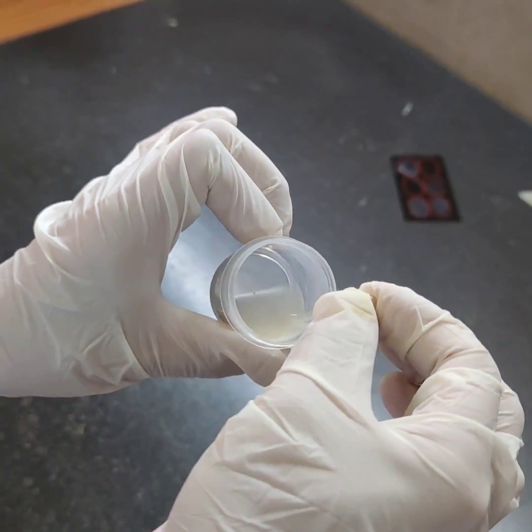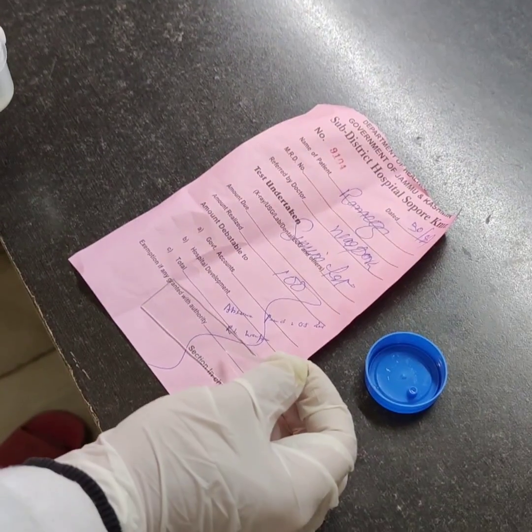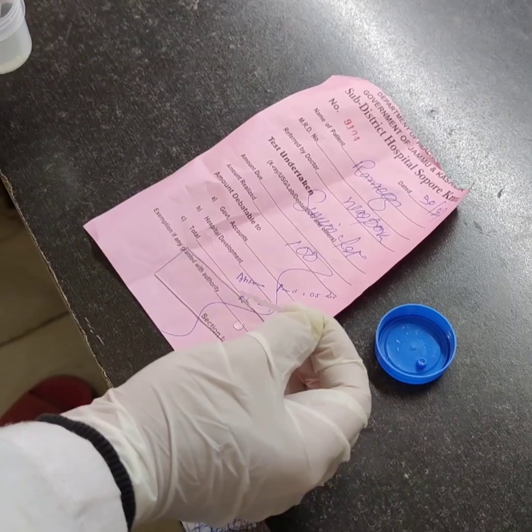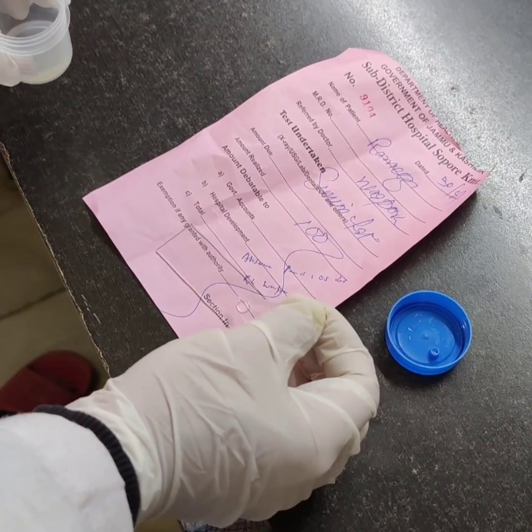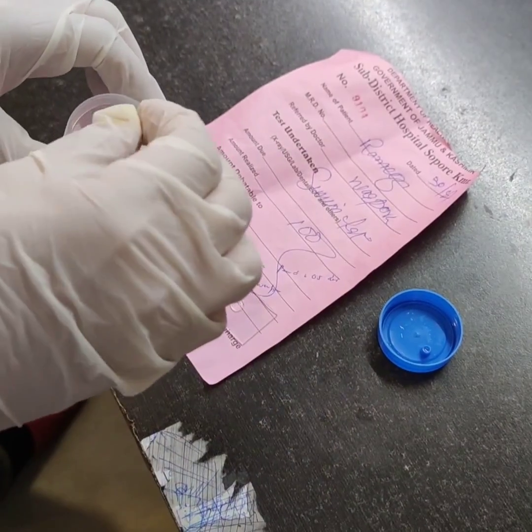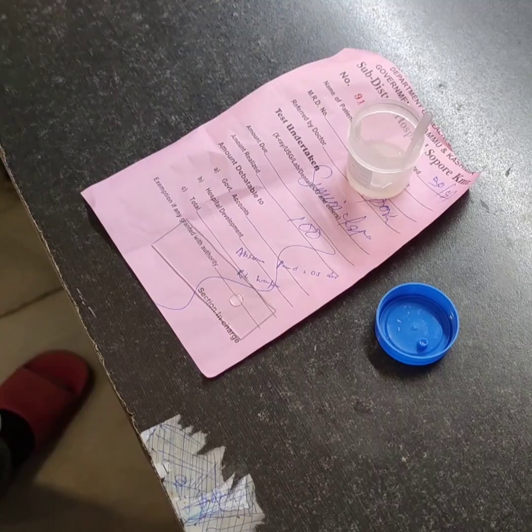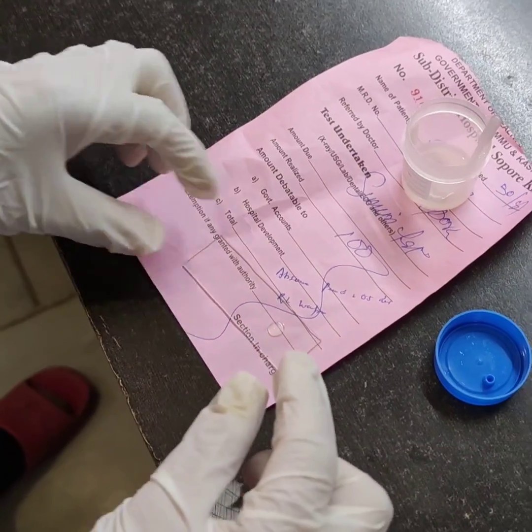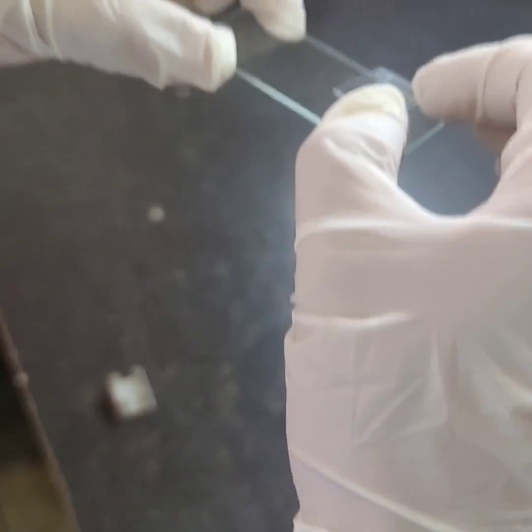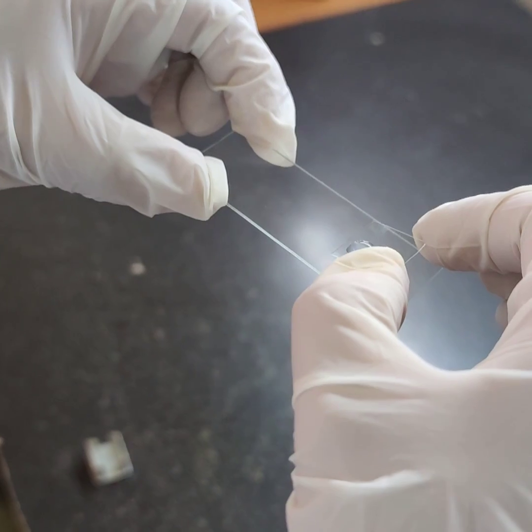If the sample is properly liquefied, now put a drop over the slide. Now put the coverslip and place it over the drop. Make sure that the coverslip is properly cleaned.